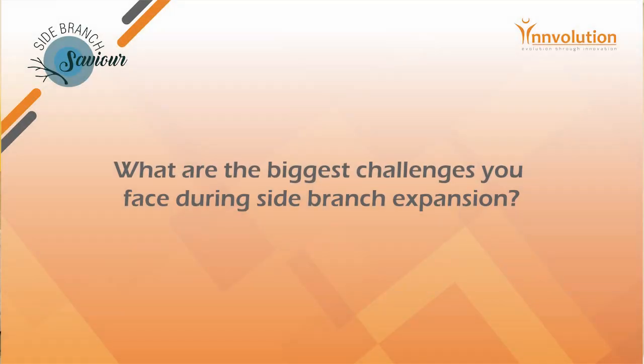Side branch protection is mainly done by keeping a wire inside the side branch. Side branch expansion all depends on the stent quality, stent profile metrics, and the bed preparation.